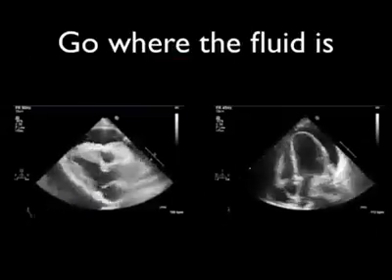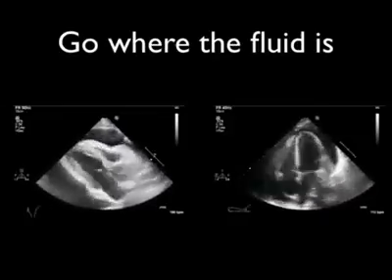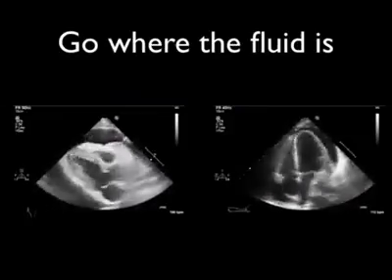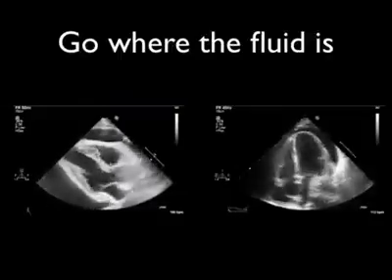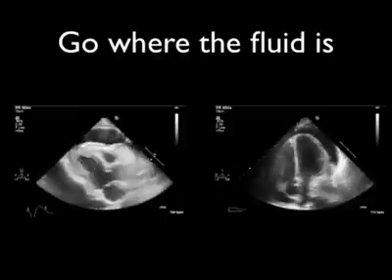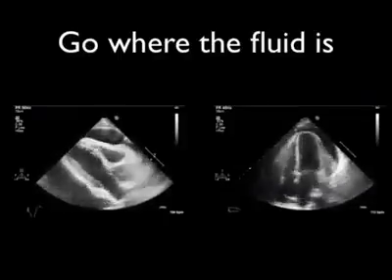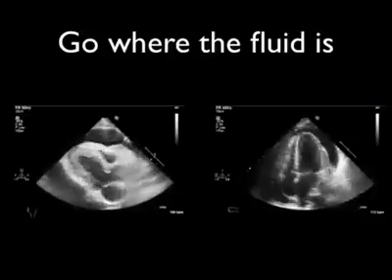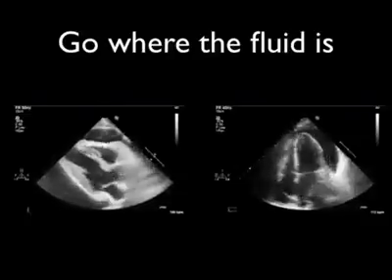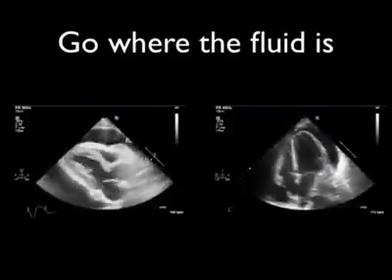Go where the fluid is. It's important to remember that with pericardiocentesis there is no margin for error. So wherever the pericardial effusion is the thickest is probably where you should go with your needle. If that happens to be parasternal, even though Malin said don't do it on his little podcast, go for it. Whatever you're most comfortable with. So apical, subcostal, parasternal, wherever that effusion is the largest is probably going to give you the best chance of success without taking out a ventricle and placing a catheter in someone's aorta.